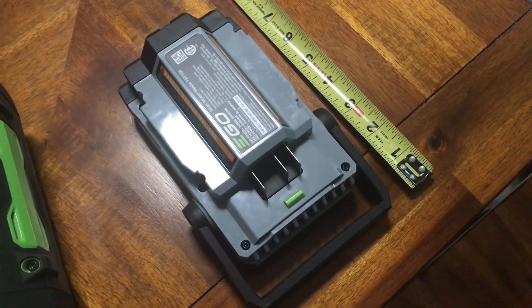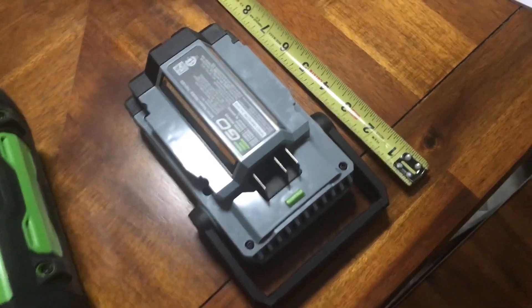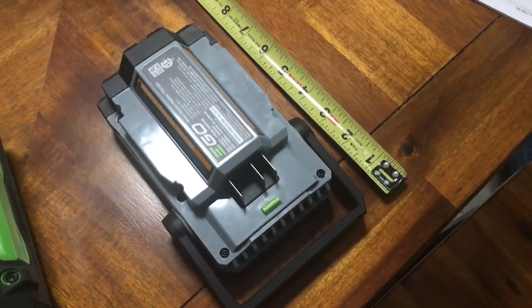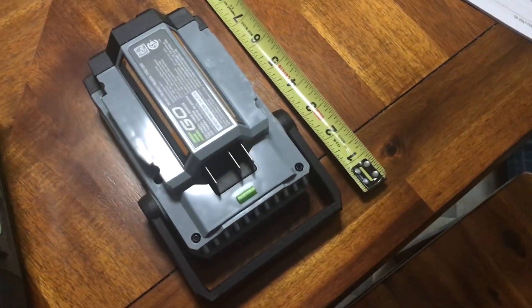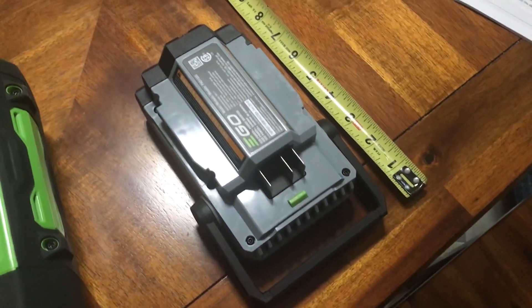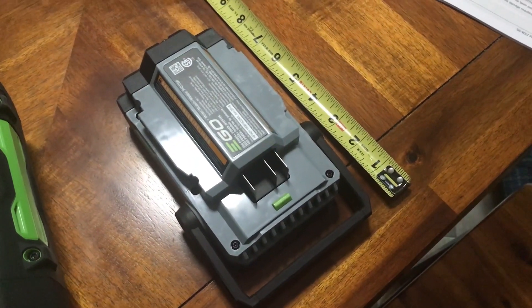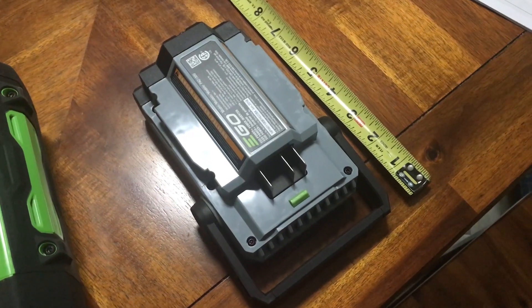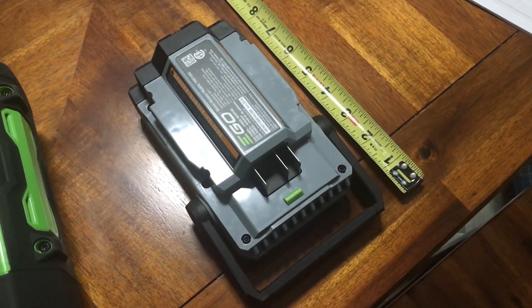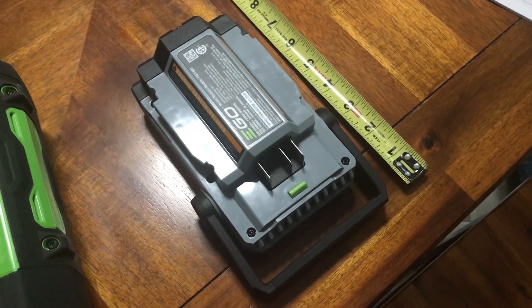I just received the new Ego Power Inverter that they released and are running a sale on through about the end of September. I went ahead and ordered one because I've got a lot of Ego equipment and figured this might be useful, especially if I wanted to use it to run my CPAP — whether for a power failure or if I went camping.